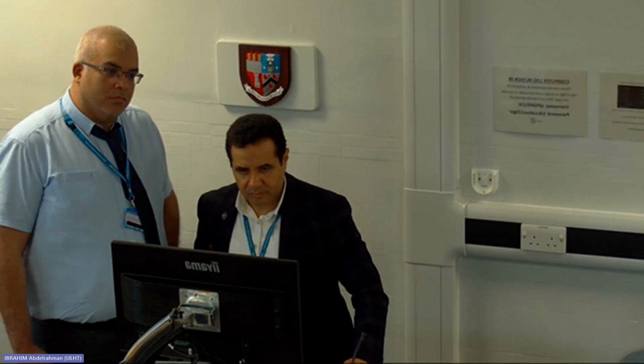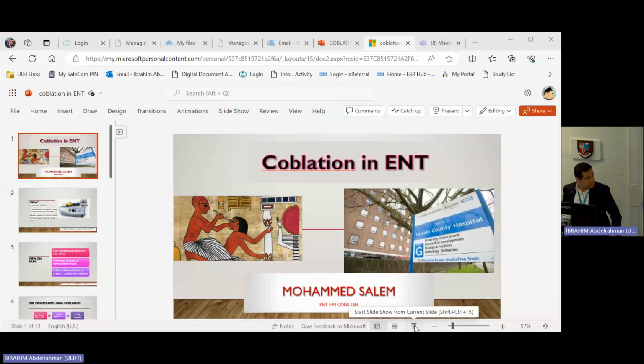Yeah, there's loads of papers out there for extracapsular. In 2017, coblation was used for about 11% of tonsillectomy procedures. It's now up to 50%, and that's because of extracapsular. Back in 2017 and before, over the previous 15 years of coblation, everyone would use all sorts of different modalities, and there'd be lots of papers comparing the different techniques, whether it was bipolar scissors, steel and ties, bipolar or diathermy, whatever you use.